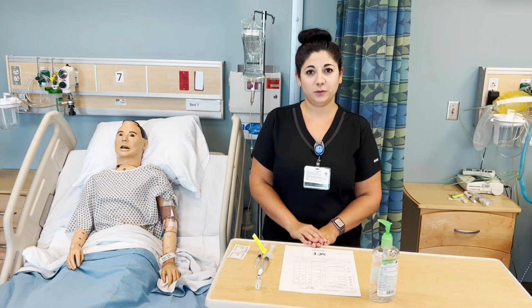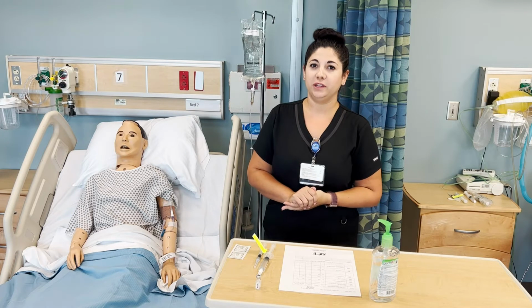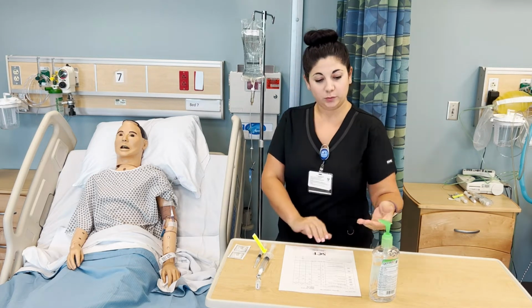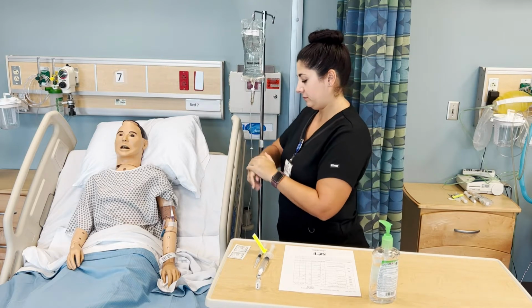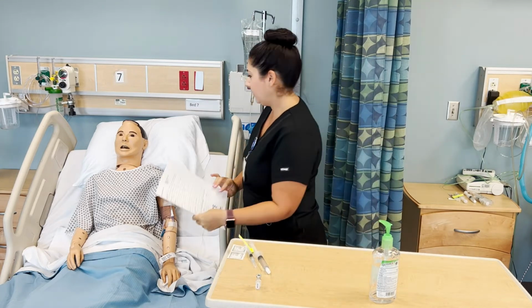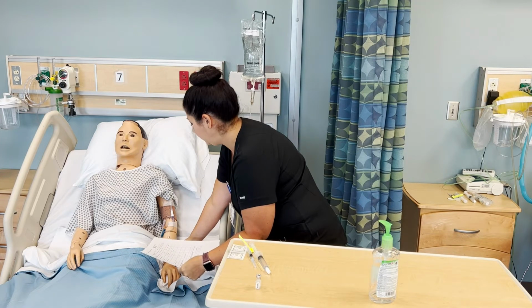I have knocked on the door and come into my patient's room. I've introduced myself and told the patient that we are giving an IV push medication. I'm going to wash my hands and identify my patient. Can you tell me your name and date of birth? Okay, and do you have any allergies?